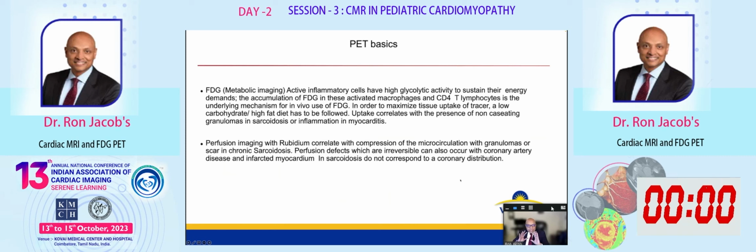So these are PET basics, and most of the people in this audience, again, are probably very familiar with this. But under fasting and aerobic conditions, long-chain fatty acids are the preferred fuel in the myocardium, as they supply about 60 to 70% of the energy for the working heart.